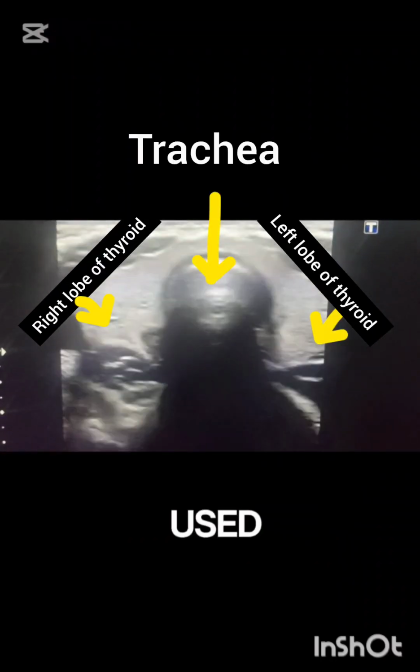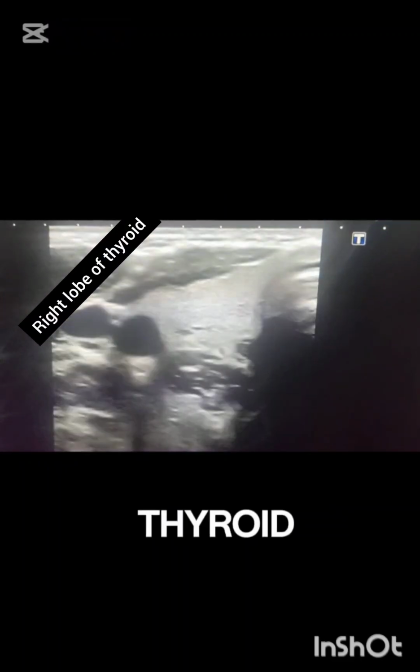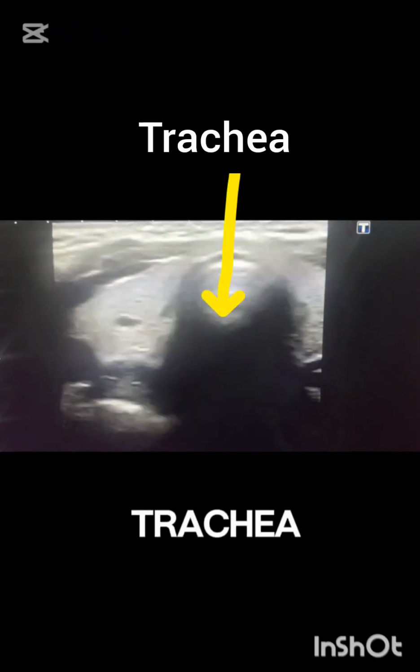Thyroid ultrasound is a non-invasive imaging technique used to assess the structure, size, and echotexture of the thyroid gland and surrounding cervical structures. In a normal study, the thyroid gland is typically located in the anterior neck, with right and left lobes, lying on either side of the trachea and connected by a thin isthmus.